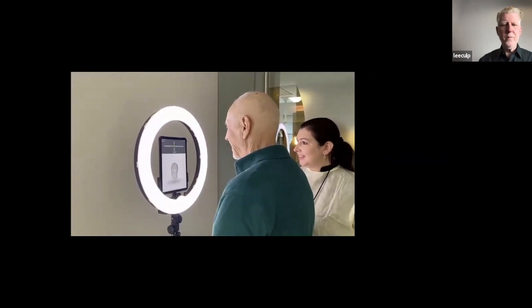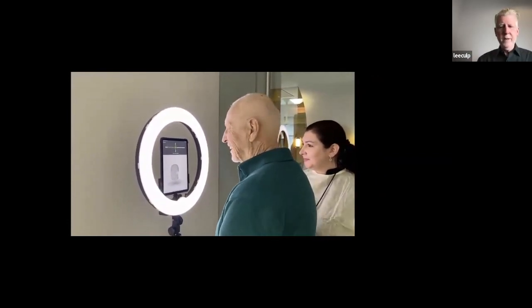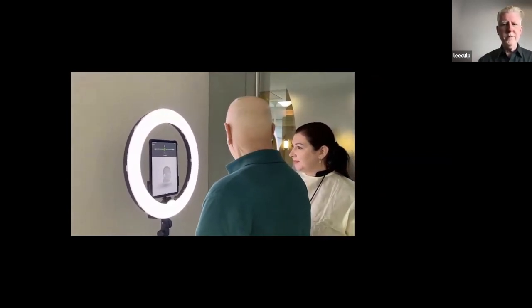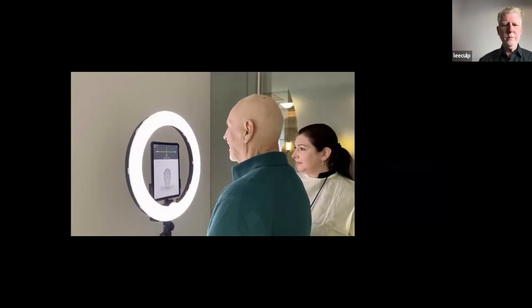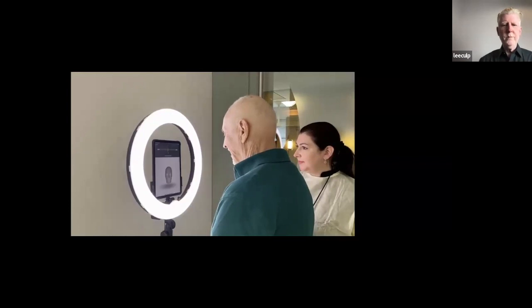Camera. Turn left. And this was our setup. This is my wife. Turn to the middle. She's faculty in prosthodontics. Turn at right. UNC. Turn to the middle. Tilt your head up. Turn to the middle. Tilt your head down. Turn to the middle. Capture completed.